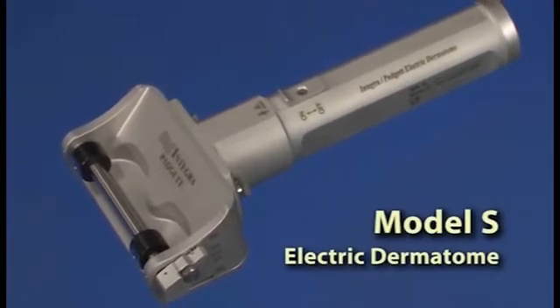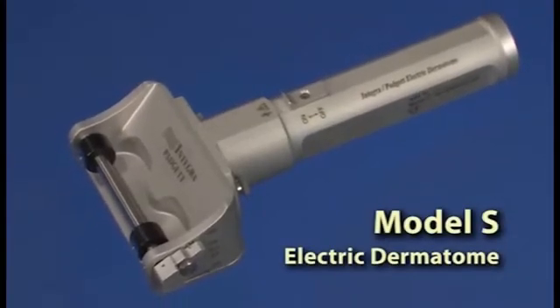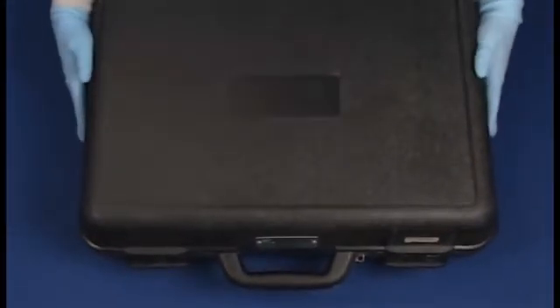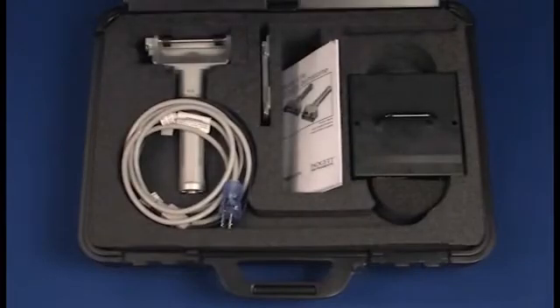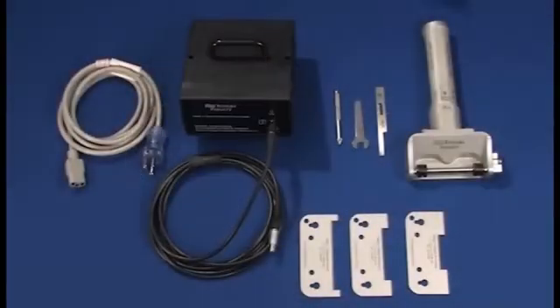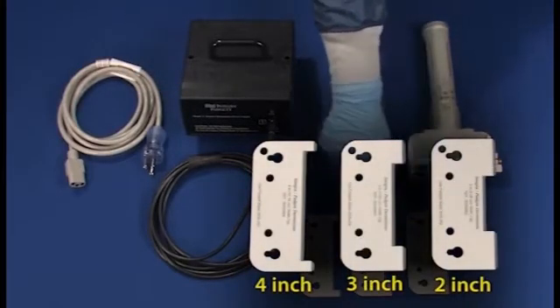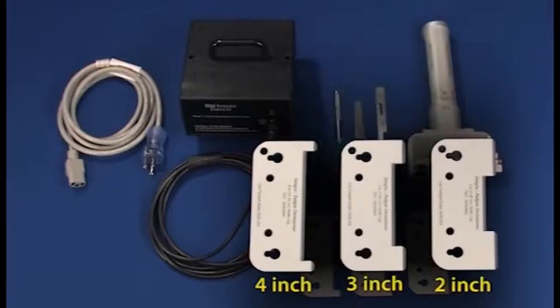The Model S is designed to provide speed and accuracy in cutting skin grafts in a variety of widths. The Model S electric dermatome comes complete with a plastic storage case. Inside you'll find the electric dermatome unit with the power cord, the power pack, and three width clips to harvest 2-inch, 3-inch, and 4-inch grafts. A 1-inch clip is also available from Integra by special request.